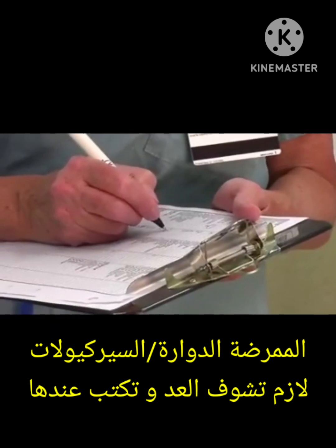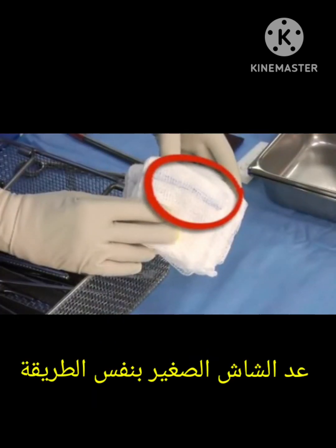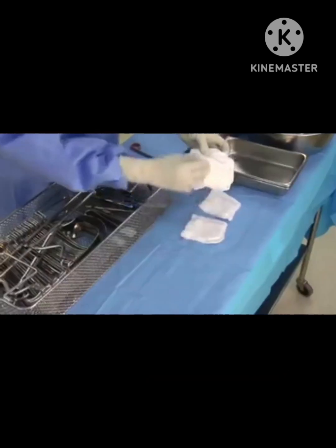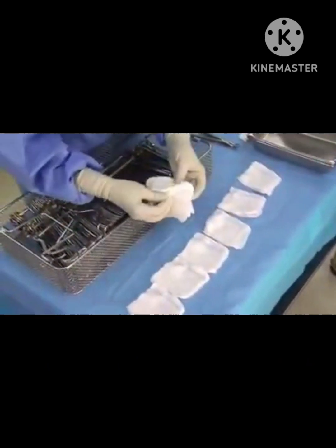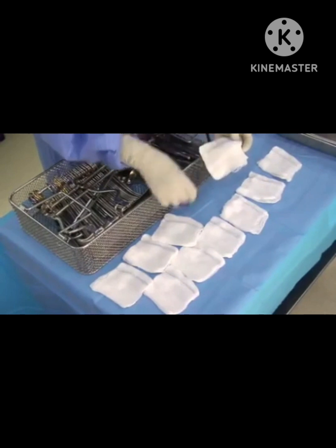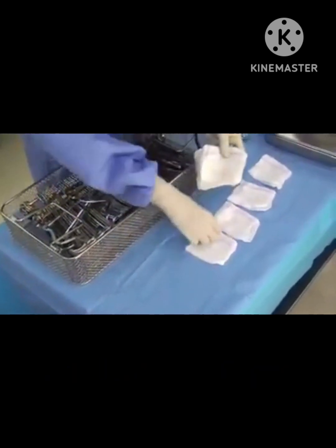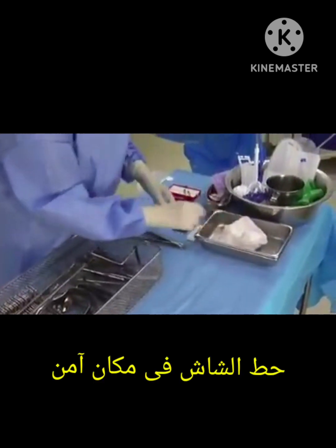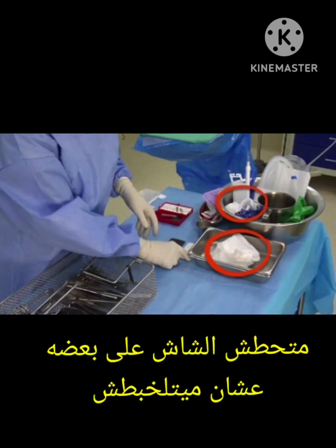Count the sponges back into one hand, hold by the radio-opaque tags, and pull to check that all tags are secure. Place sponges where they will be used. The circulating nurse needs to clearly see each item counted and will document as the count proceeds. Count slowly so the nurse can follow. Count the radio-opaque gauze sponges next, using the same actions, laying each sponge separately on the table.